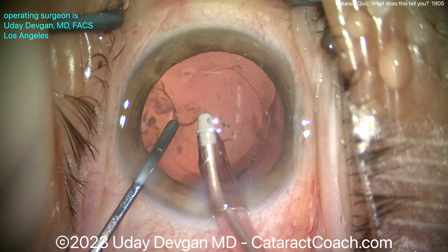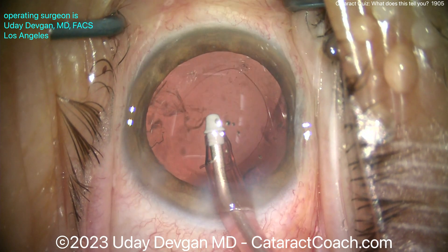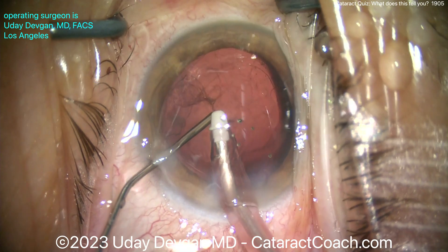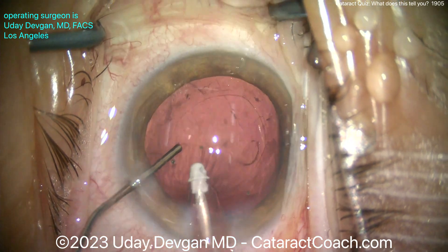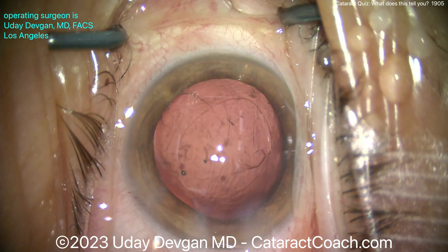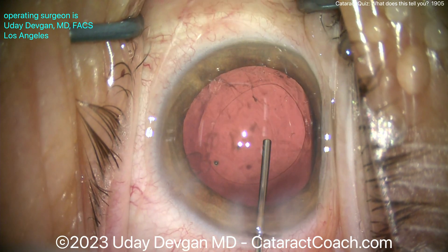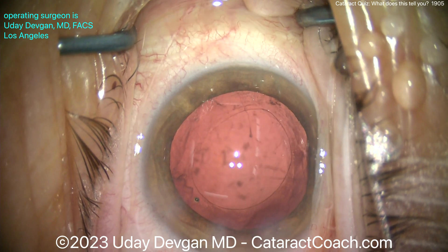Let's not be too much of a perfectionist — let's back-flush that a little bit. We can wash those down; we can always come back and take out that last little bit. That little bit is easy enough to remove after we get a CTR in. Remember the saying for CTR: put it in as early as you need it, but as late as you can. There's the cohesive viscoelastic filling up the capsular bag. Look how the I/A probe isn't pulled out of the eye until we fill it with viscoelastic. Now you've got a nice expanded bag.